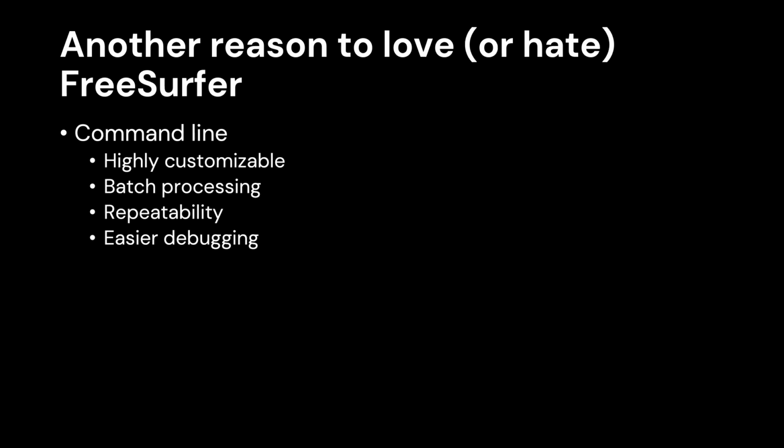And third is, when you have a program in command line or in bash, you can replicate your analysis quite easily. You just basically save your code and run it again, and you can also share it with other people, and they will be able to run the same thing that you built. And finally, it's easier for debugging.